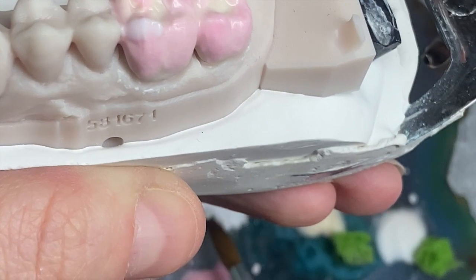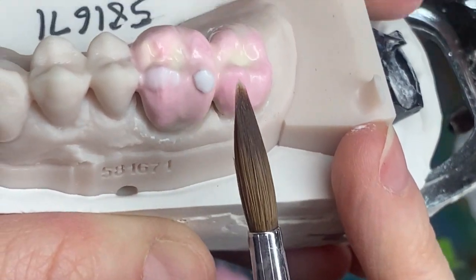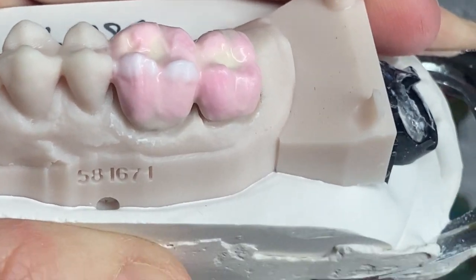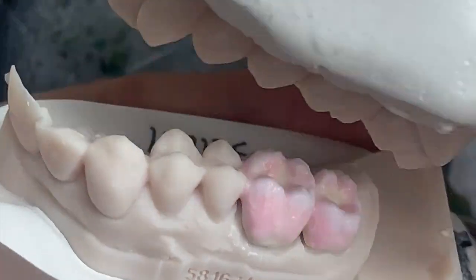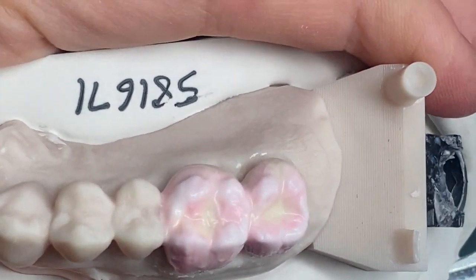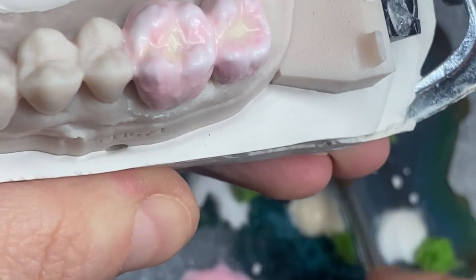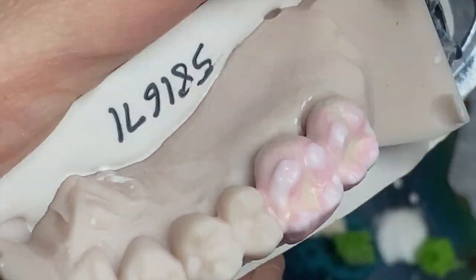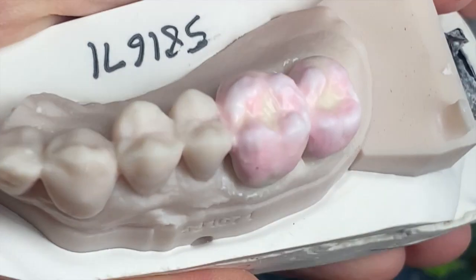So now I'm applying clear porcelain, and now I am going to apply regular enamel. You see my moisture is too high.